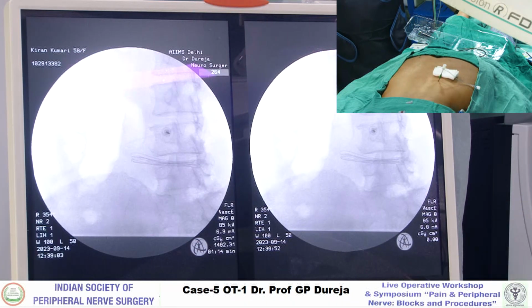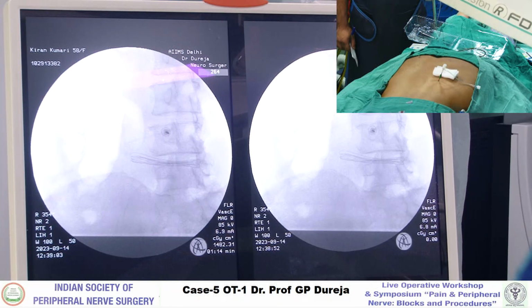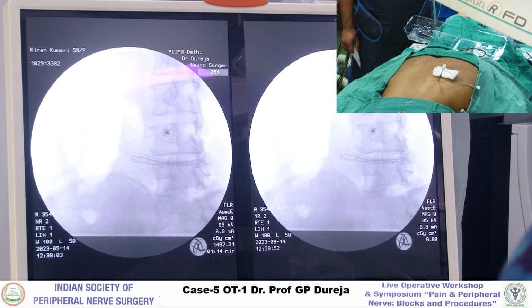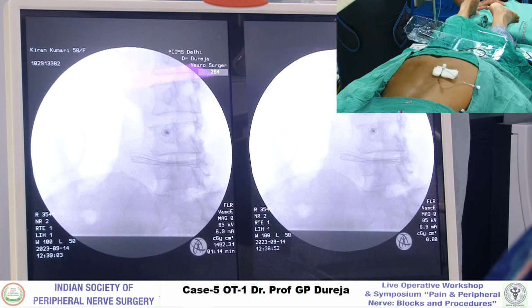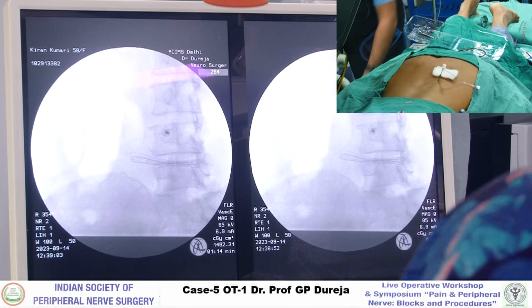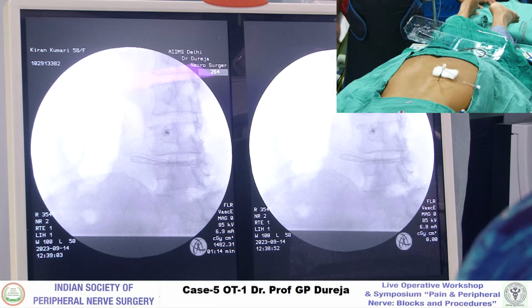Okay, lateral. So we are right at the eye of the Scotty dog. This is a 17 gauge needle. It produces a lesion of 15 mm. So you can go spot on, but otherwise if you are using the standard RF, then you have to be lying close, parallel to the bone. Then you can go from a segment below.